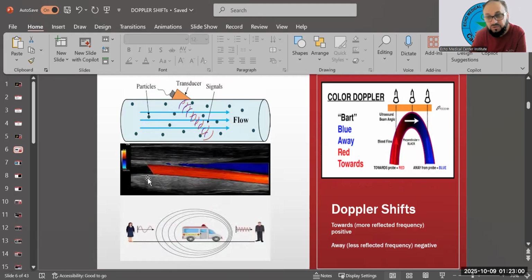Okay. So now, once again, like I mentioned earlier, you can see here too, pretend this is a vessel, the blood is coming that way, and the vessel is like a curve, just like the aortic arch. We have the ascending aorta, transverse, and descending thoracic aorta, correct? So just pretend it that way. Now, if your probe is here, the flow is going towards it, and the pulses are coming down.